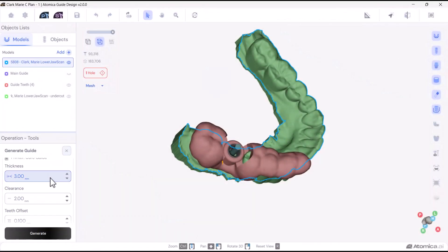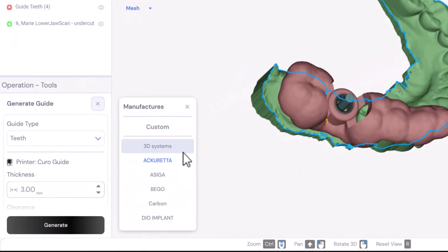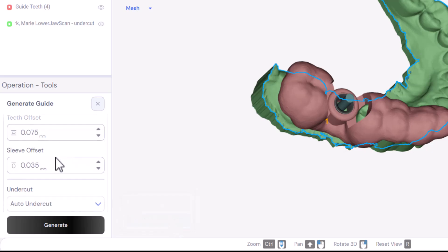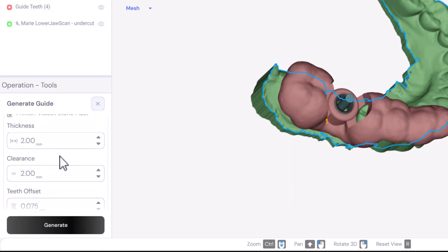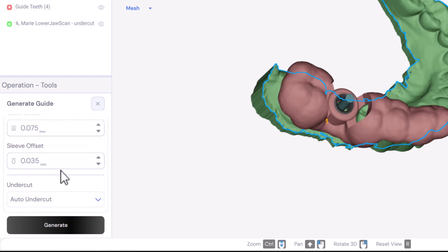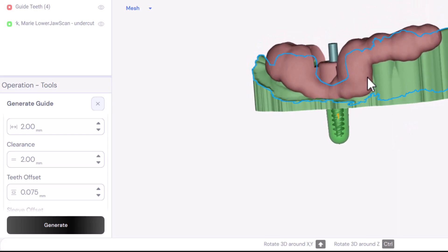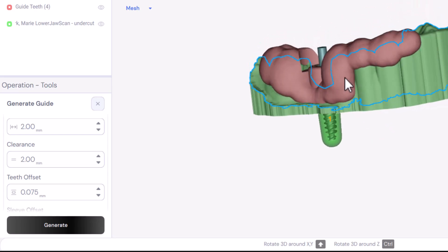This parameter should also be adjusted to the size of the sleeve. All these parameters, especially the offsets, depend on the type of printer and the printing material used. Atomica's design app allows you to select the printer and material, and the parameters will be automatically adjusted according to the manufacturer's recommendations. However, you still have the flexibility to manually edit these parameters as needed. By fine-tuning these parameters, you can create a surgical guide that is robust, fits perfectly, and enhances the precision and success of your surgical procedures.